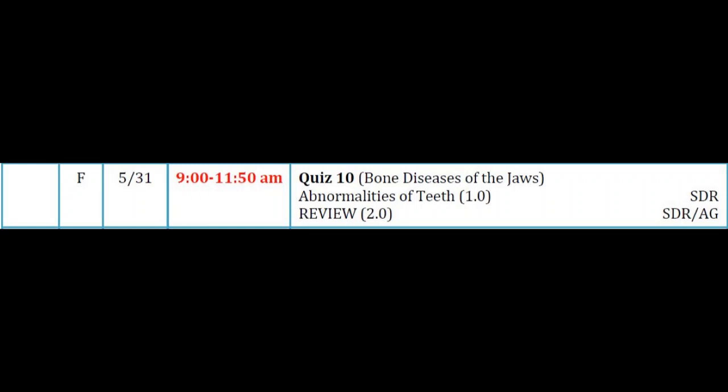Number 8, this was a little harder one. This is an 8-year-old who has had a slowly enlarging jaw lesion for a couple of years, and you can see there's bony expansion. You can see there's displacement of teeth clinically and radiographically. When we look at the radiographic lesion, start with the character. Is it lucent, opaque, or mixed? It is a pure lucency.